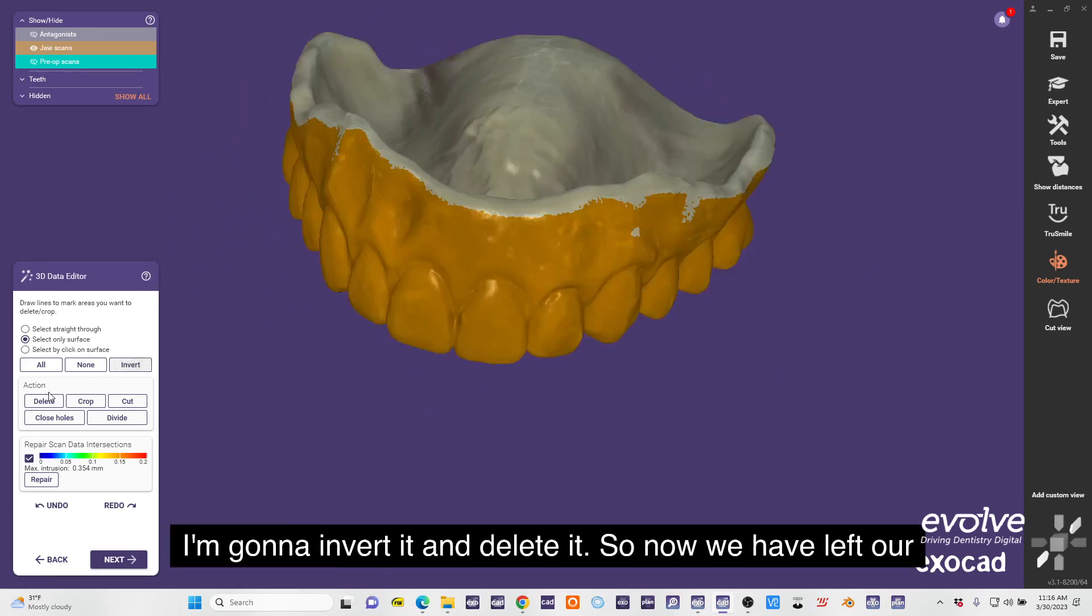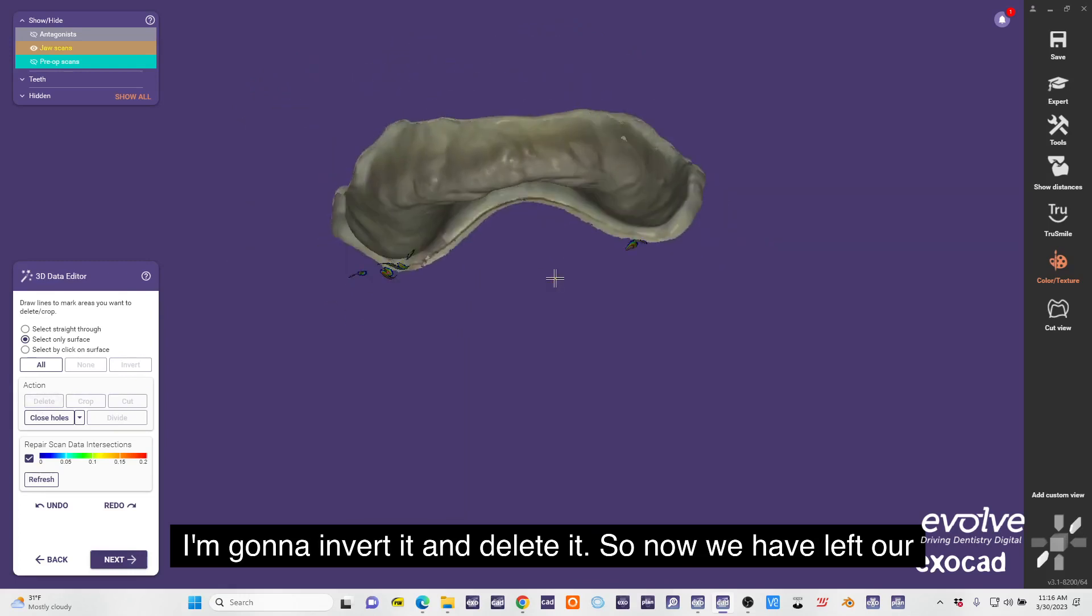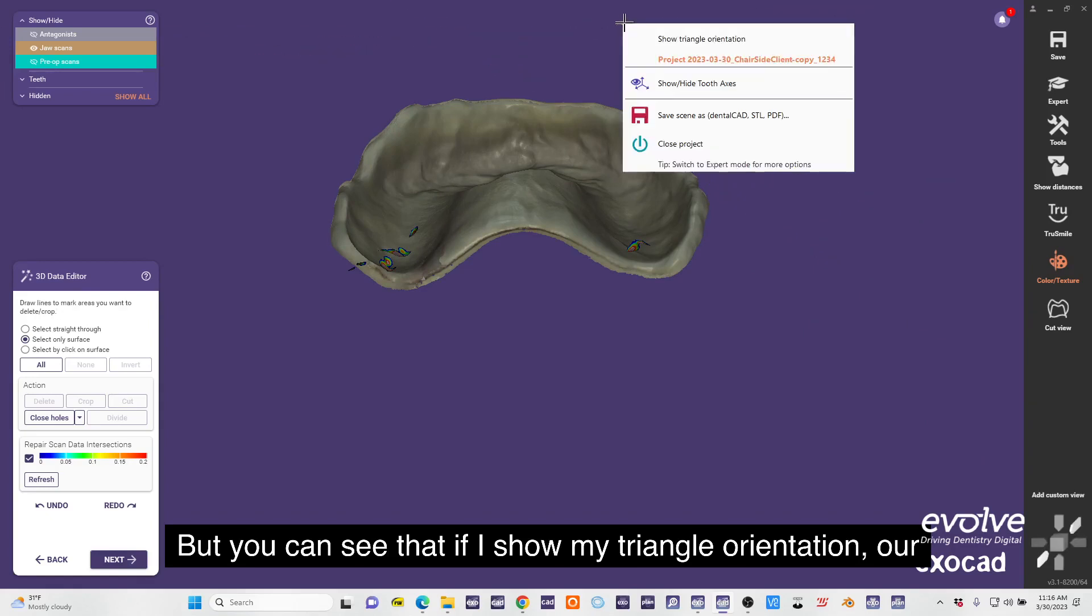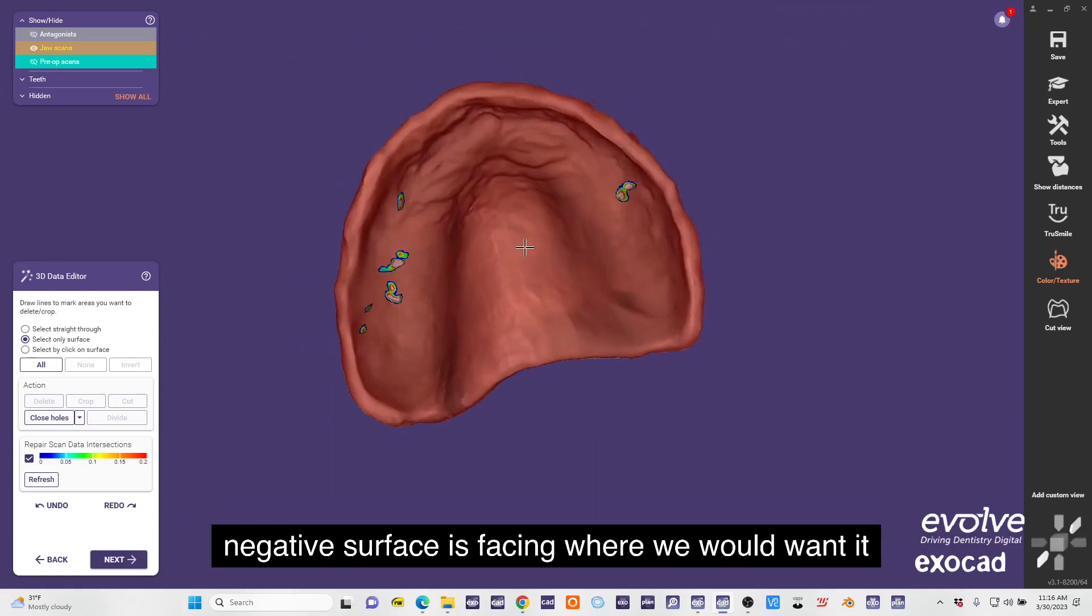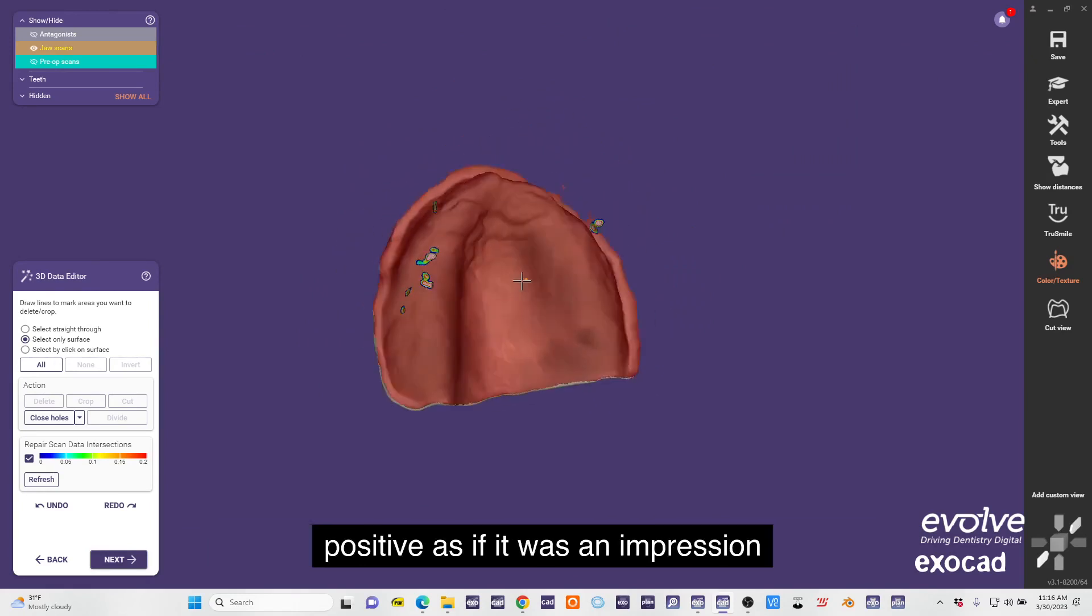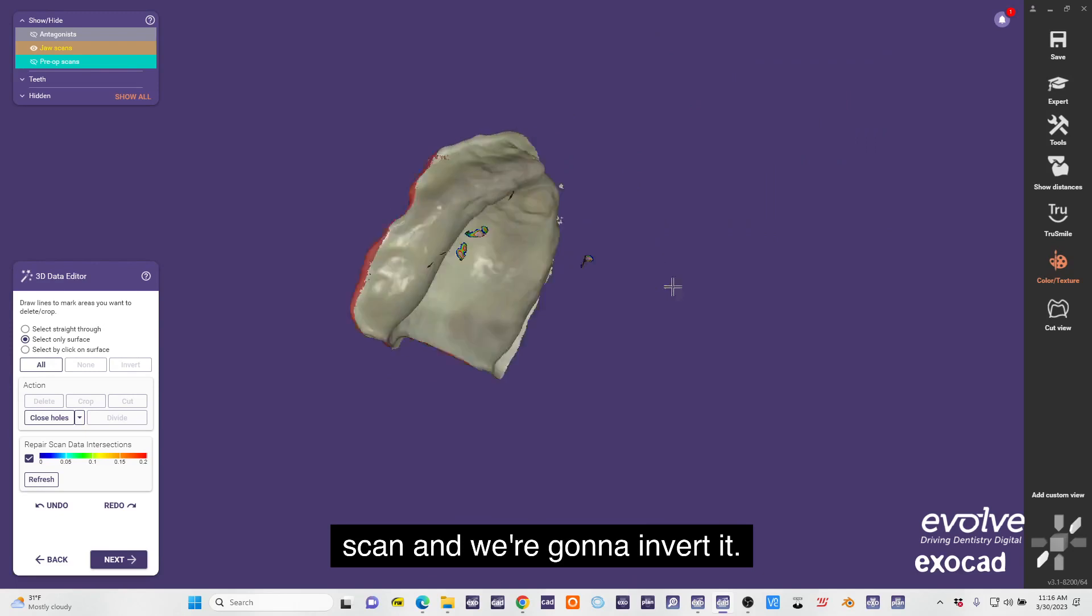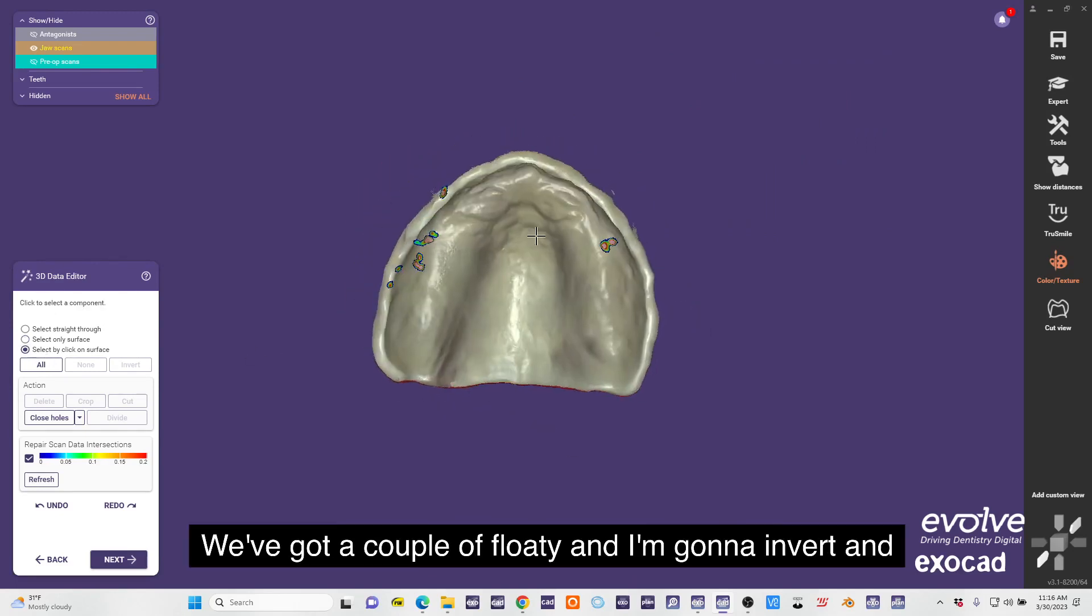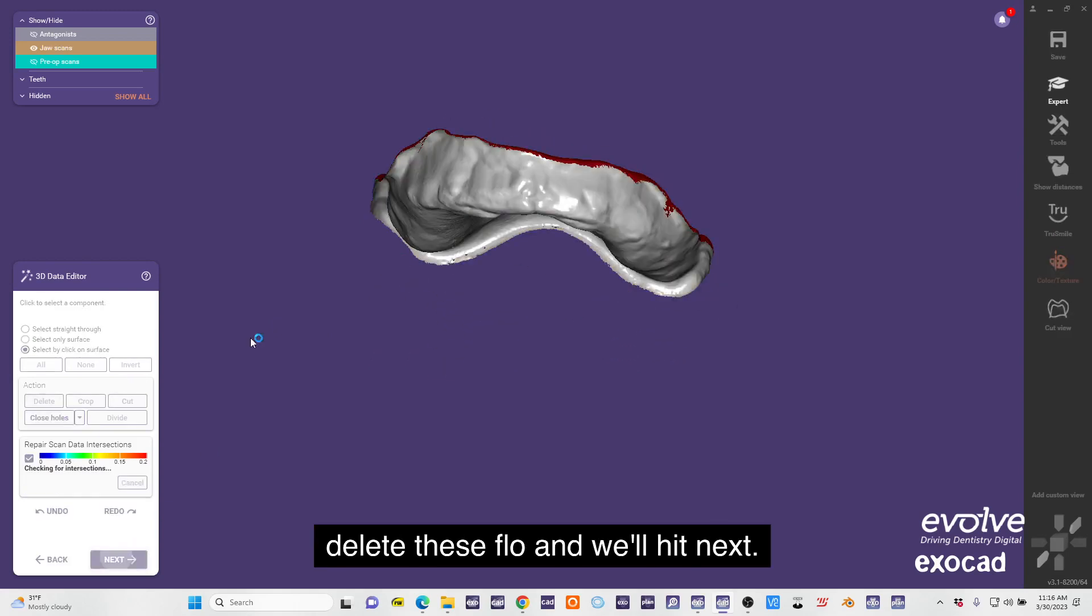I'm going to invert it and delete it, so now we have left our intaglio just like before the model. But you can see that if I show my triangle orientation, our negative surface is facing where we would want it positive, as if it was an impression scan. We're going to invert it so now that's kind of like a model. We've got a couple floaties and I'm going to invert and delete these floaties and we'll hit next.